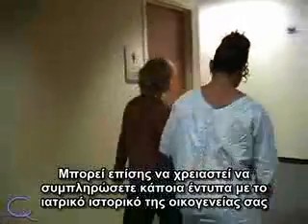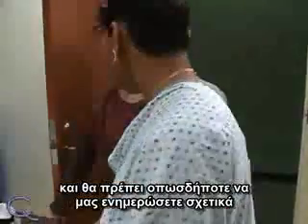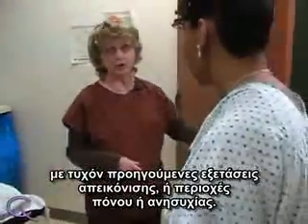You may also need to fill out forms about your family's medical history, and you should definitely inform the technologist regarding any previous imaging tests, areas of pain, or concern.